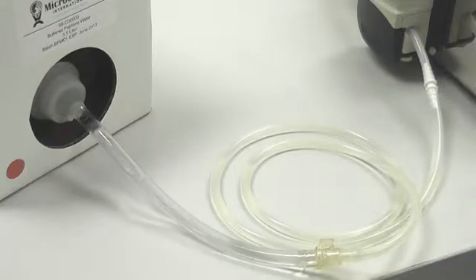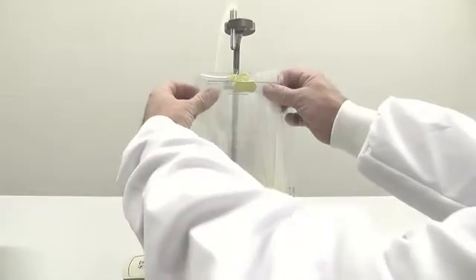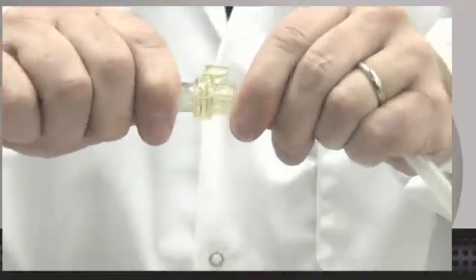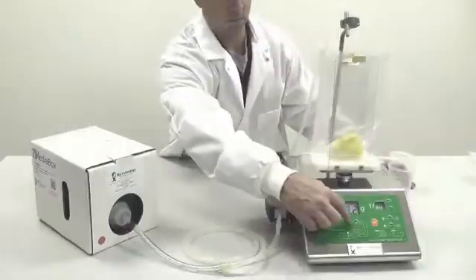MediaBox has been designed to be environmentally friendly and is recyclable. For smaller laboratories who do not have the staff or equipment to make their own media, MediaBox provides ready-to-use liquid culture media at an affordable price. With MediaBox, it's as simple as click, flip, and enrich.